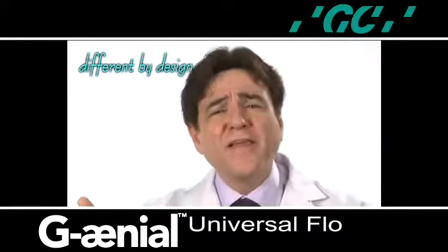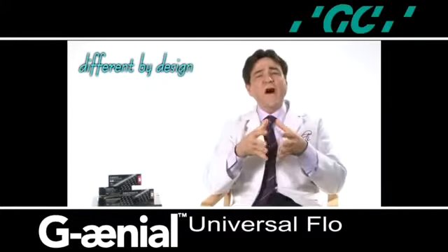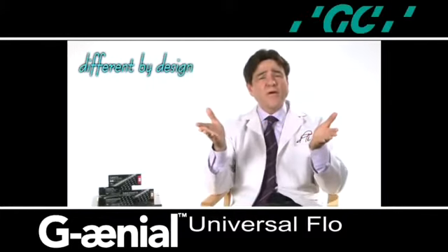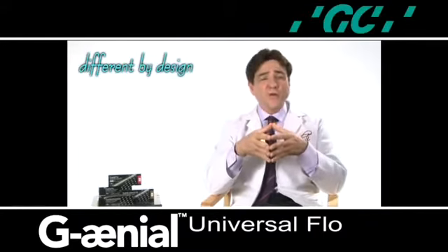And what other material has so many uses than these next-generation flowables? The following presentation will describe a few of those many contemporary applications utilizing G-aenial Universal Flo.